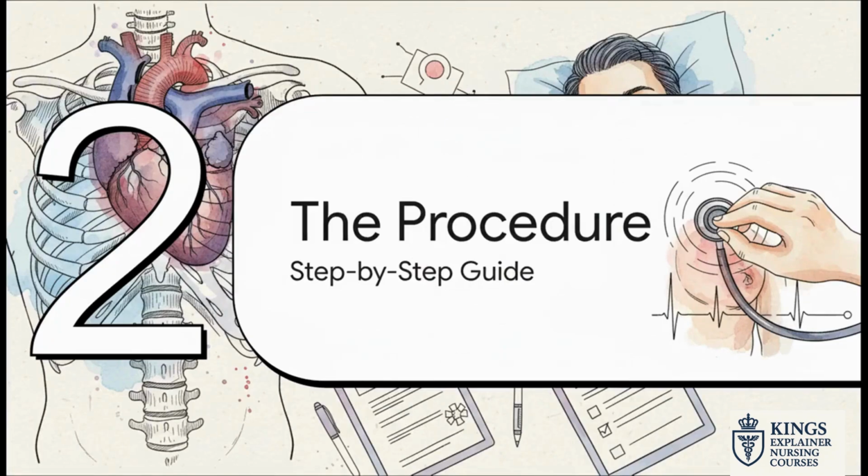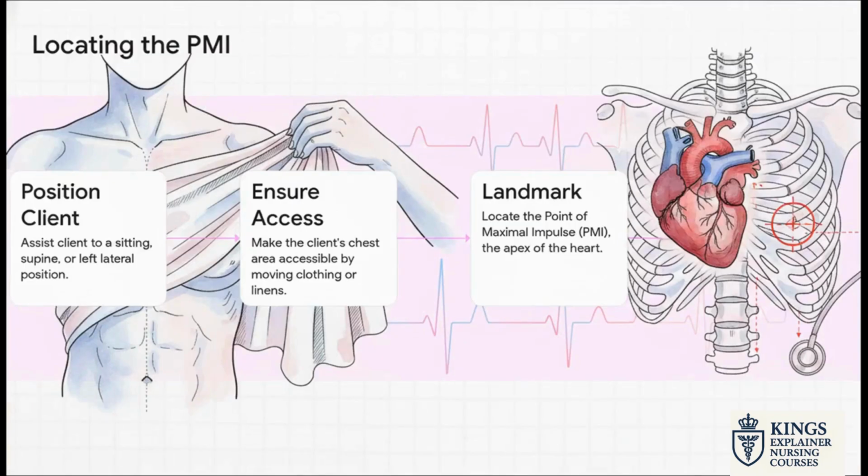All right, moving on to Section 2, the procedure itself. Our prep work is done, we're at the bedside, and this is where all that anatomy knowledge and clinical technique really come together. First up, position your client for success. Supine or sitting up is standard, but here's a pro tip. Having them roll slightly onto their left side can actually bring the heart's apex closer to the chest wall, which makes it way easier to hear.